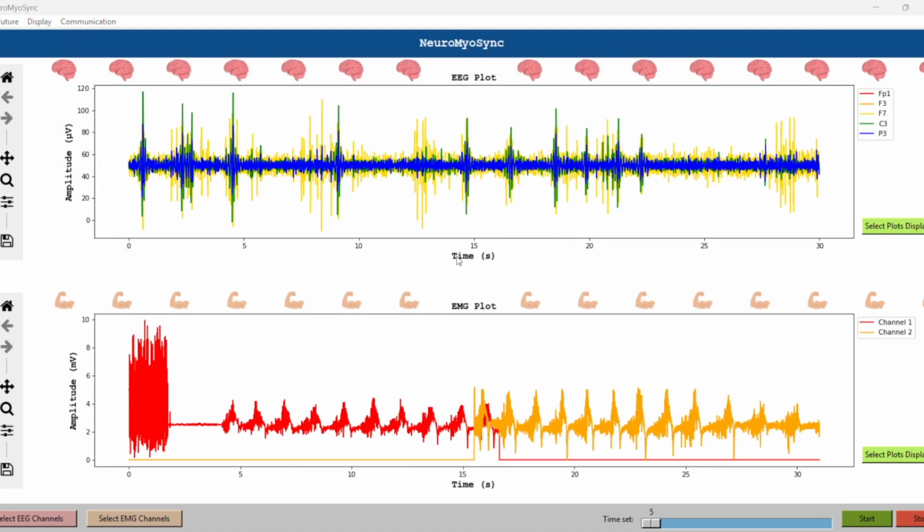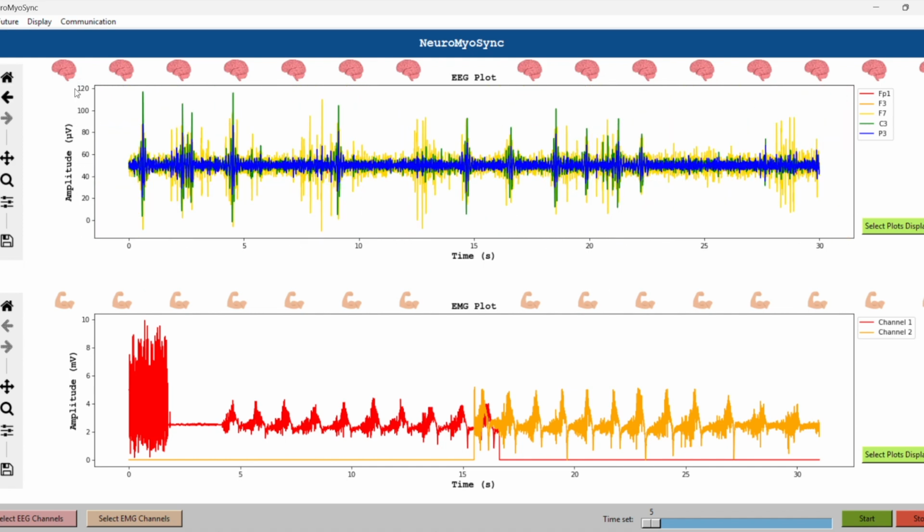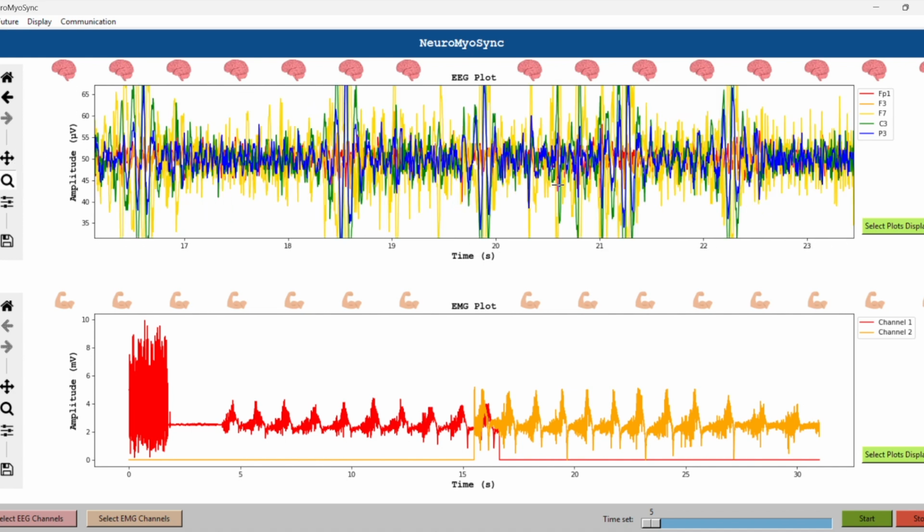Once a trial has been completed and the data has been saved, you can select File and open in either individual EEG or EMG or a combined file for a trial. Here I've done that already, and our EMG plot shows a split trial where it switches from channel 1 to channel 2 during the trial period. So when you open the plot, you can zoom in using your scroll wheel and then reset back to the original view. You can also pan along the data and zoom to certain regions.